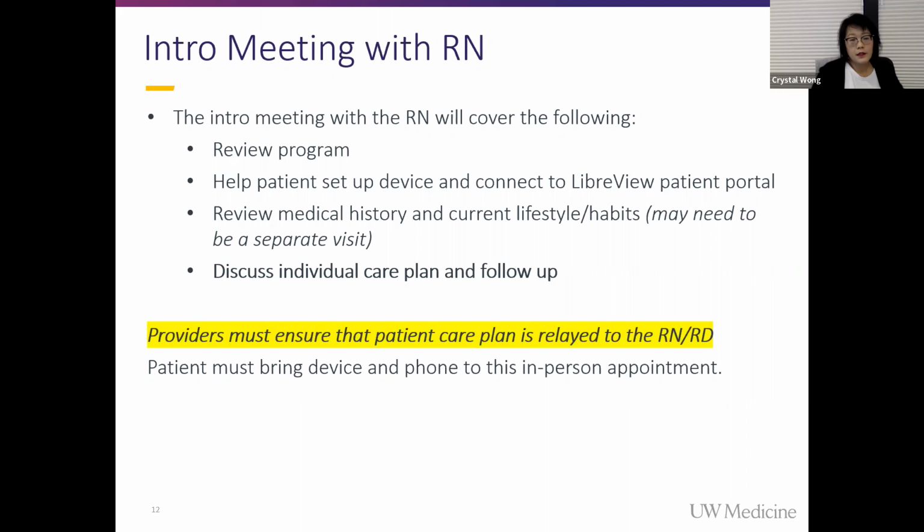This is the subject matter of the intro meeting with the RN. So they'll review the program, help the patient set up the device, help them put on their sensor, make sure they feel confident in using it, and then go through some medical history and lifestyle and habits, maybe set some goals to discuss the individualized care plan.